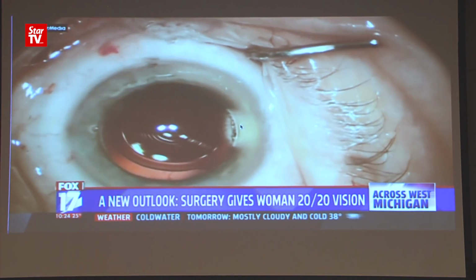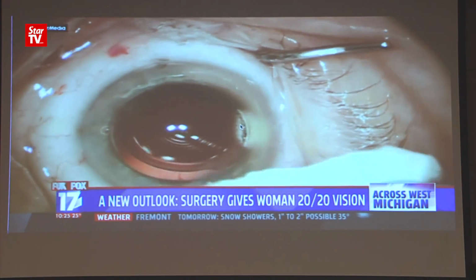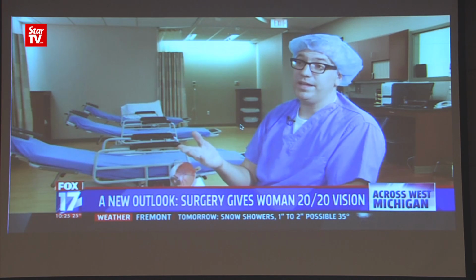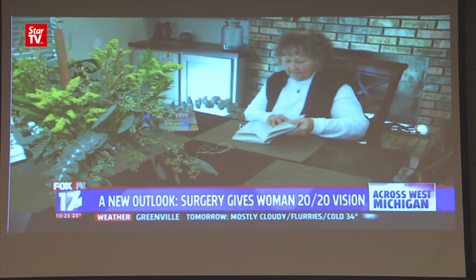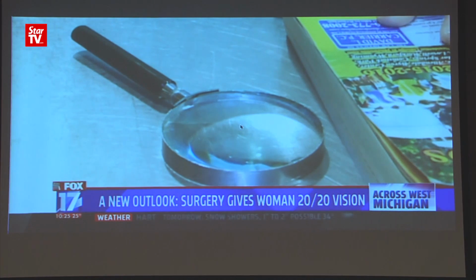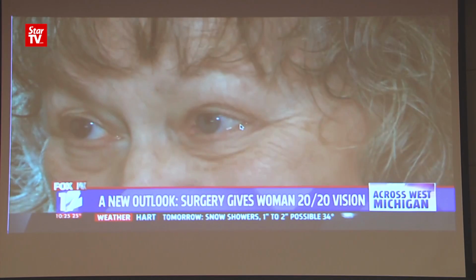Less than 10 minutes later, Dr. Snyder places that new lens in Peggy's eye. This lens creates 2 images, a near one and a distance one. The side effect of that is that you have some glare and halo at night. That treatment, combined with a multifocal lens, is letting Peggy ditch her glasses and magnifying lenses for good. I have not had that magnifying glass out once, not once.